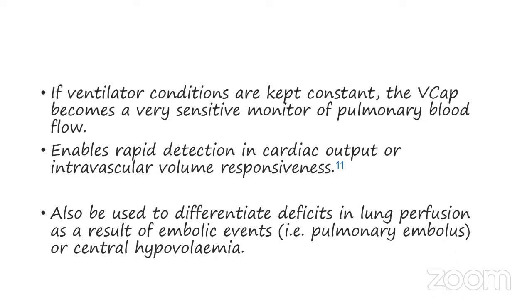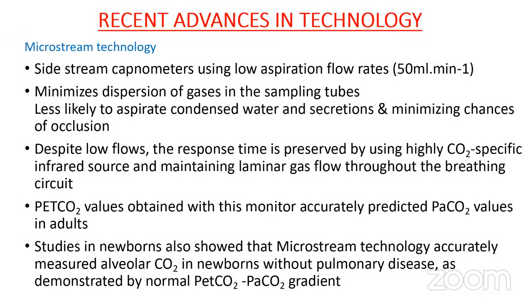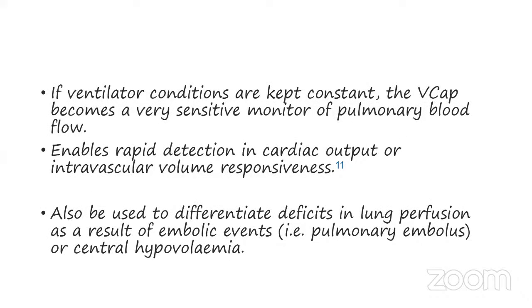It enables rapid detection of changes in cardiac output and intravascular volume responsiveness. It is also used to differentiate deficits in the lung perfusion as a result of embolic events, that is pulmonary embolism, or central hypovolemia. And at the same time, this ETCO2 monitoring is also required and a must when we are transferring patients within the hospital for radiological procedures or shifting from one hospital to another, which can detect displacement of the endotracheal tube during shifting and allow early resuscitation.